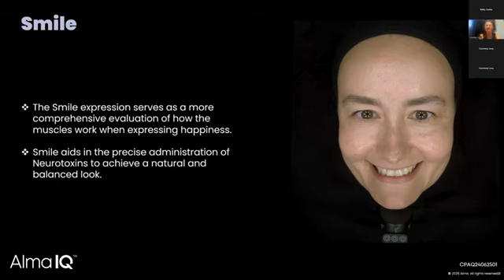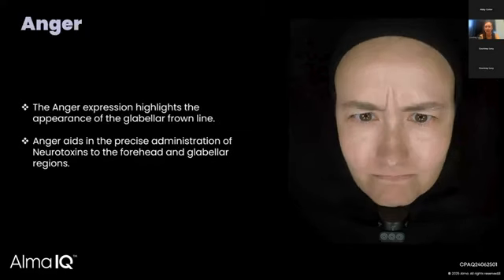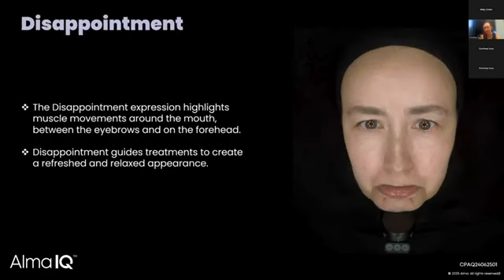What this is doing is showing the patient the effectiveness of the treatment. So it's very quick to take these facial expressions as part of the consultation process. And then when the patient comes back a month later, they can obviously see the difference in the movement of the muscles of their face and the lines that they're able to create.